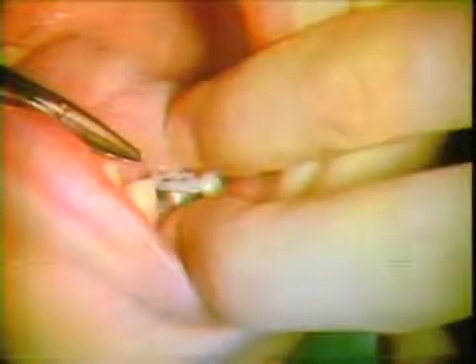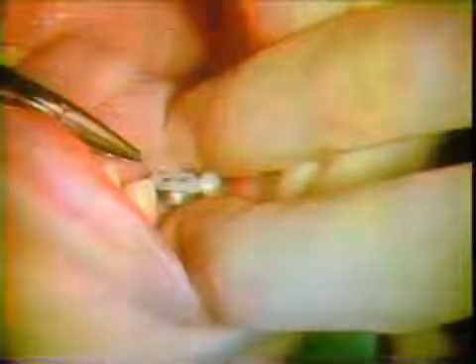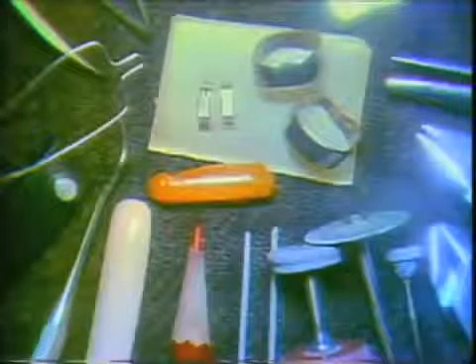This is the tying in procedure using a Matthew needle holder. This slide demonstrates the materials that you've just seen and some of the instruments in the overall view.